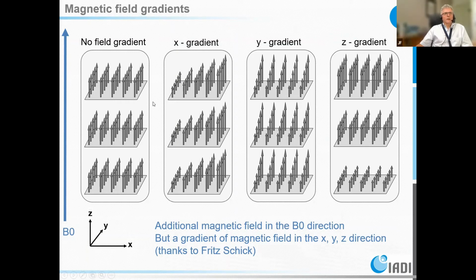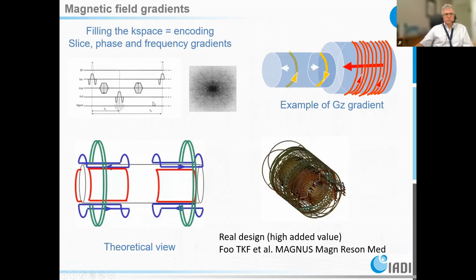Okay. So how does it work? First, you have the B0 coil here. You add only 2 extra coils here. One wire here, the current is flowing in this direction. The other one is in this direction. So you add a plus magnetic field, minus a magnetic field here.